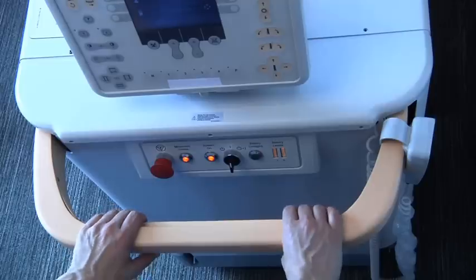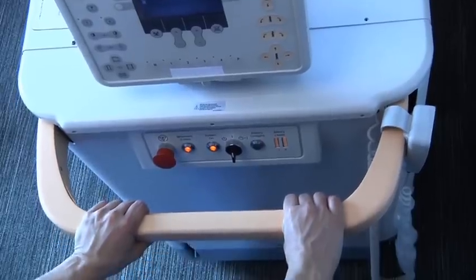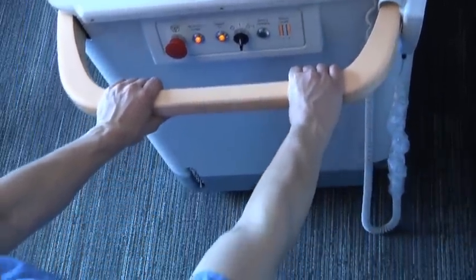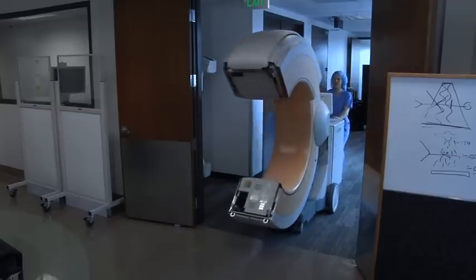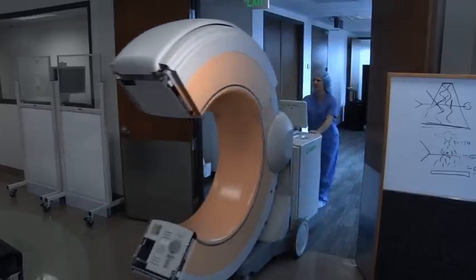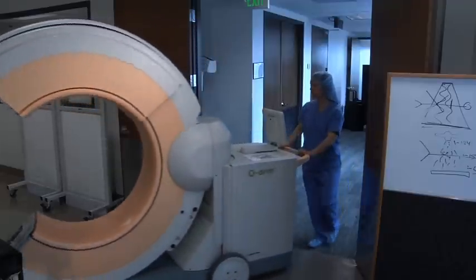Squeeze the bar on the transport handle to apply battery power to the rear wheels and gently push the system forward. Always make sure that the path you are going to take is clear, free of other equipment or cables on the floor.